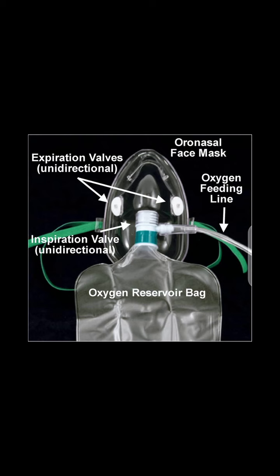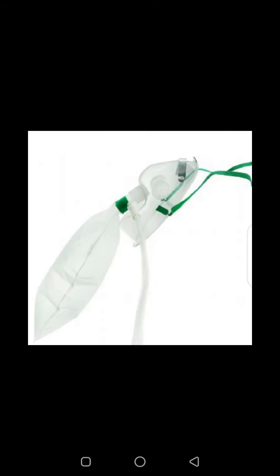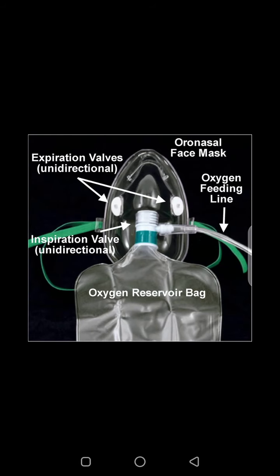It should be inflated, something like this. It is not right for the oxygen reservoir bag to be collapsed or flattened when administering oxygen with it. It must be inflated with oxygen.